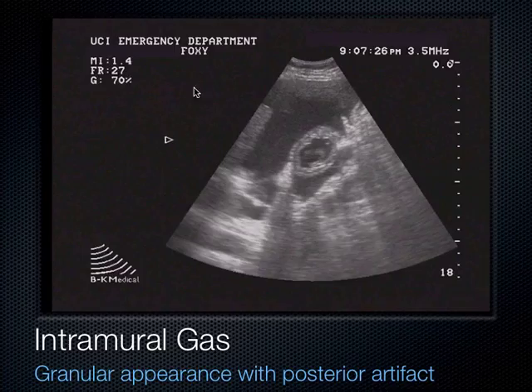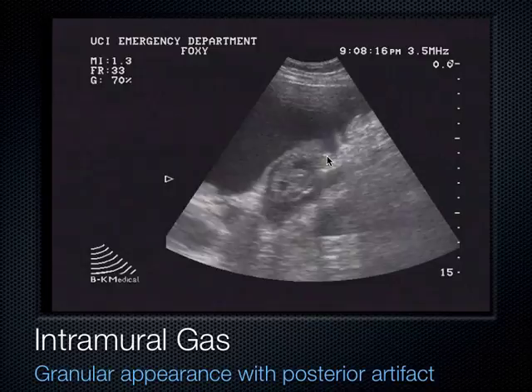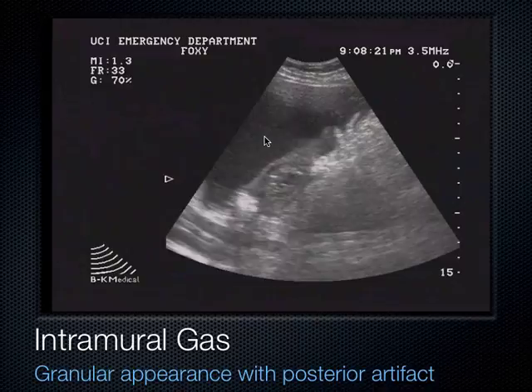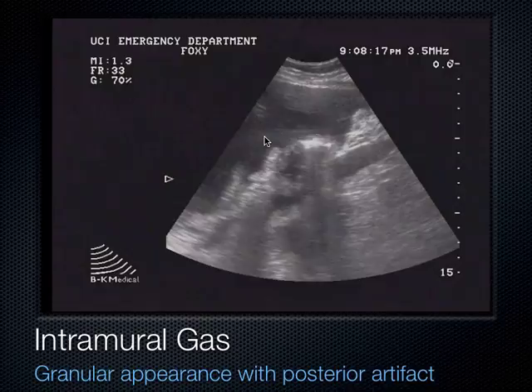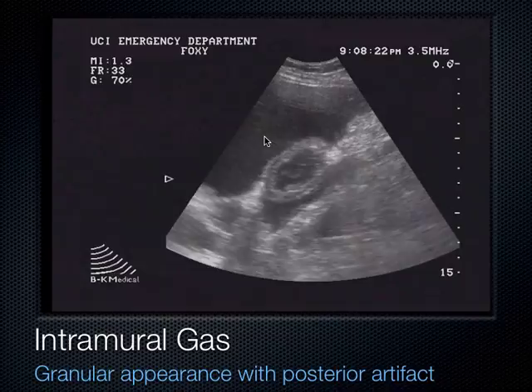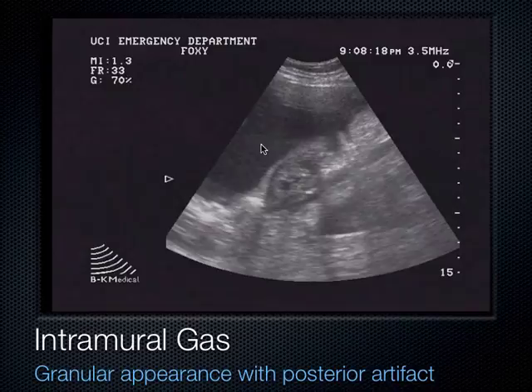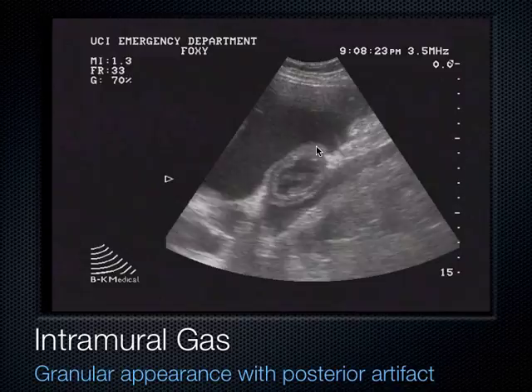Another example of intramural gas: a loop of intestines seen in a bunch of fluid. This patient has ascites — their liver stopped working, couldn't make the proteins, so fluid seeps out into the peritoneal cavity surrounding organs like the intestines. Actually it makes the intestines really easy to see. This patient was really sick and had some colitis. The thickened bowel wall plus air in the wall told us this patient was in serious trouble.